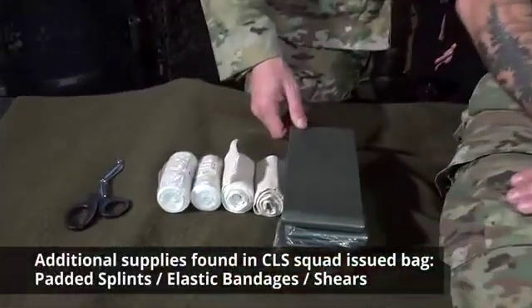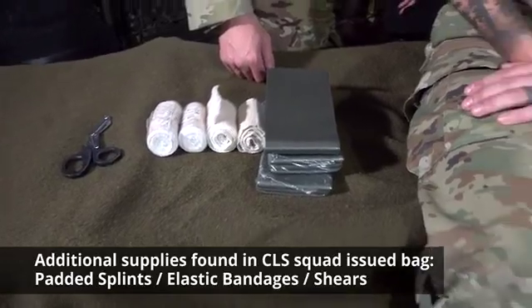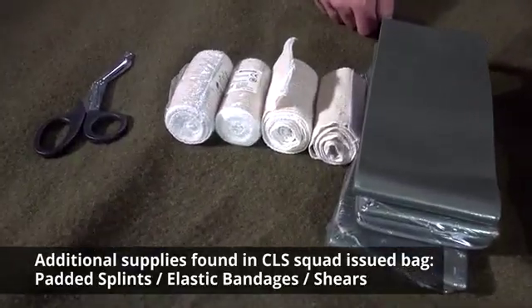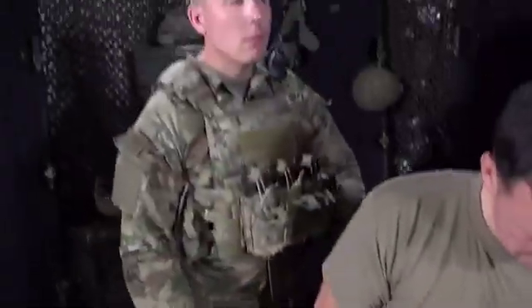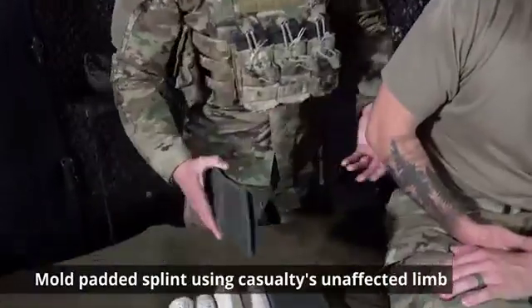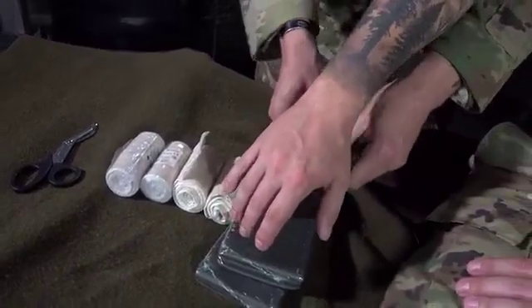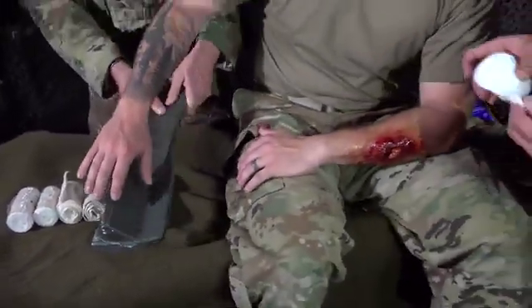We're going to need some additional supplies that can be found in our combat lifesaver squad-issued bag: padded splints, extra elastic bandages, and maybe a set of shears. My buddy Jack is going to help us mold this padded splint, and we're going to use the casualty's unaffected limb to mold it.